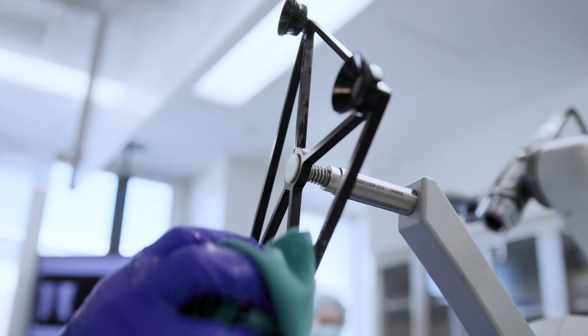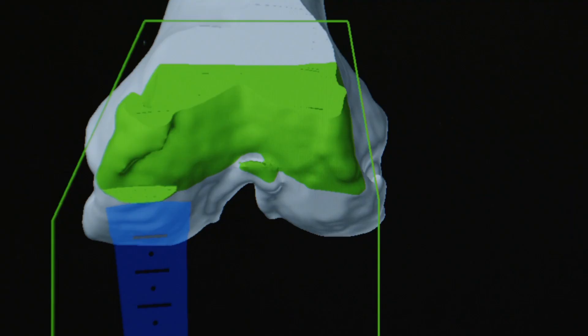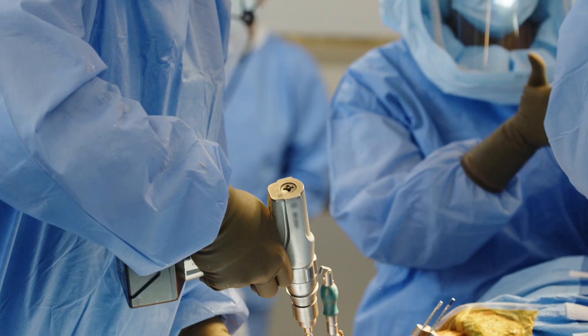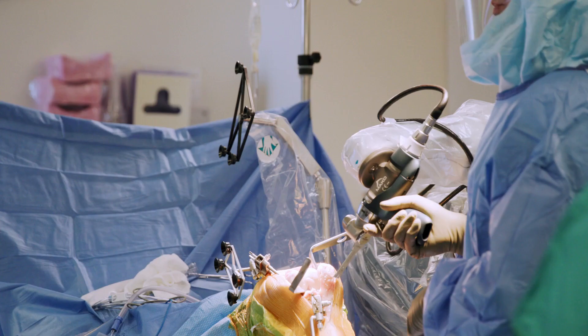Anything that causes the joint surface, which is covered in cartilage, to be damaged, uneven, or malformed, we can replace that with an implant. This device is really just an enabling tool, so anyone who can have a joint replacement can have a robotic joint replacement. It's still the surgeon using his own hands, using a very advanced, basically, power tool on a robotic arm.